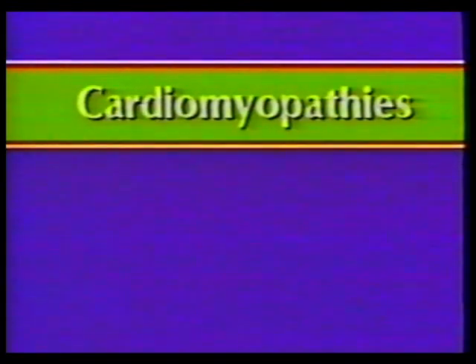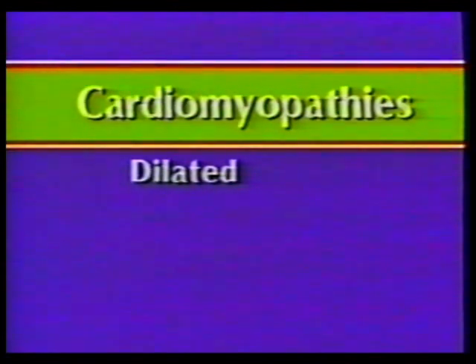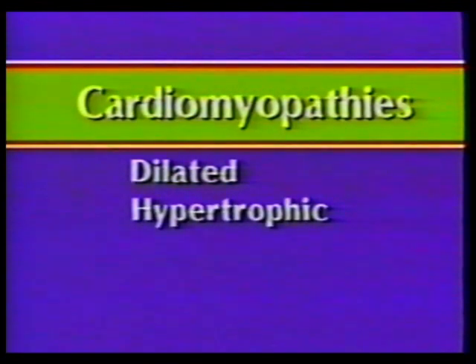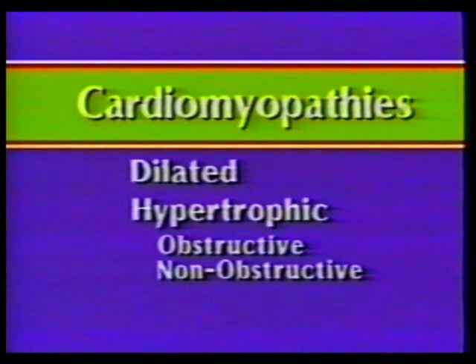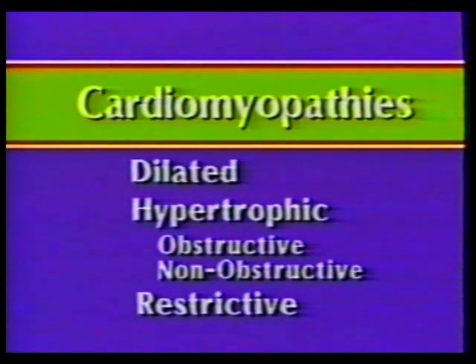The cardiomyopathies are classified as dilated cardiomyopathy, hypertrophic cardiomyopathy, which may be either obstructive or non-obstructive, and restrictive cardiomyopathy. For this video presentation, we will discuss these entities in this sequence.